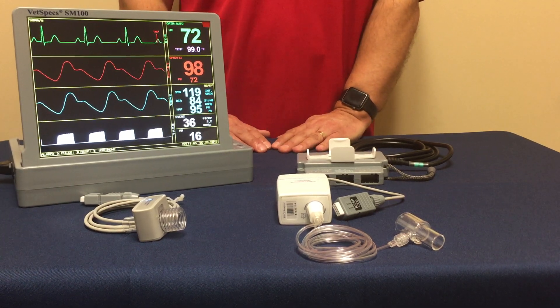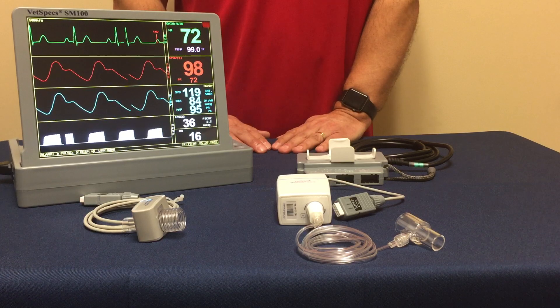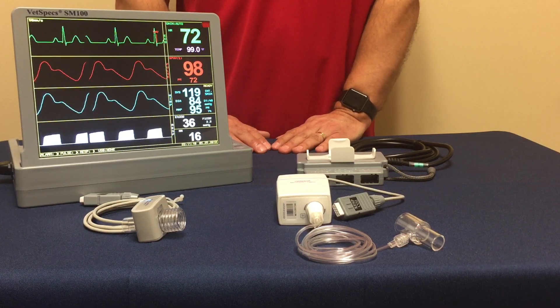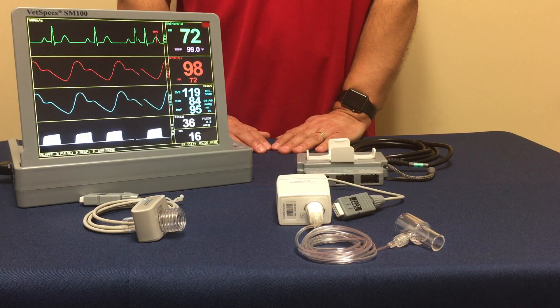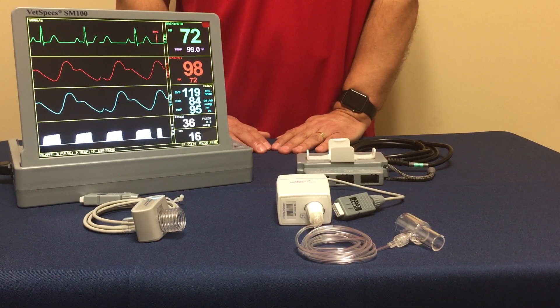Hello. As part of our summary series, we're going to be focusing on the two methods, or two options, for VETSPEX capnography in regards to their multi-parameter systems.